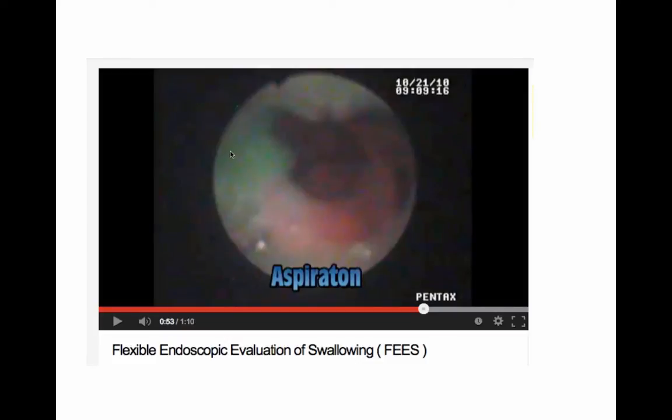Things are blue during an abnormal swallow, in this case swallowing material that goes all the way into the airway, not just on the surface of the vocal folds. That's because we mix blue dye with the substances that we ask someone to swallow during FEES. That way we can be assured that when we look down and we see material, we know it's not just mucus. We know it's actual PO substance that was swallowed and, if it's touching the vocal folds and going below, it's aspiration.